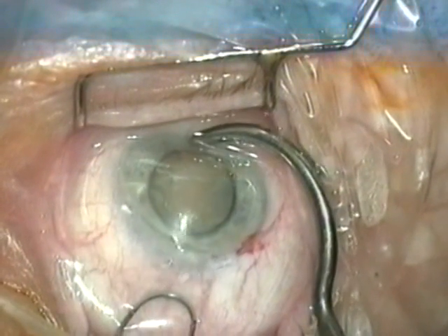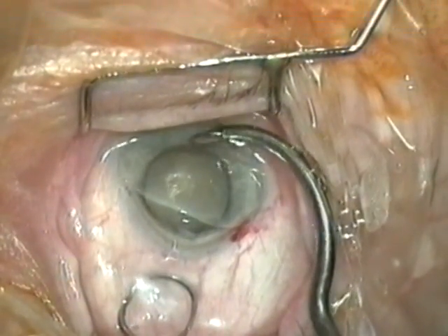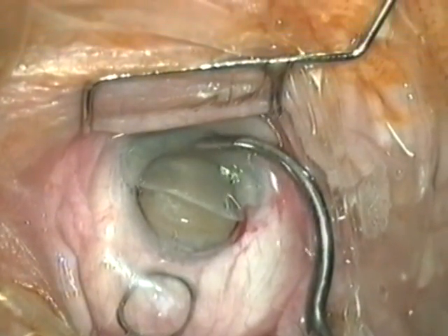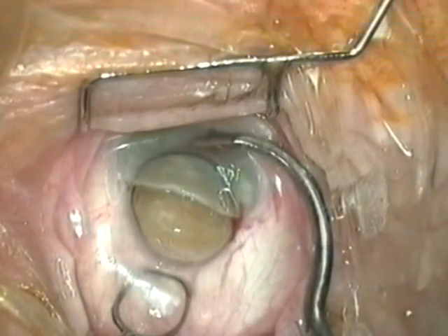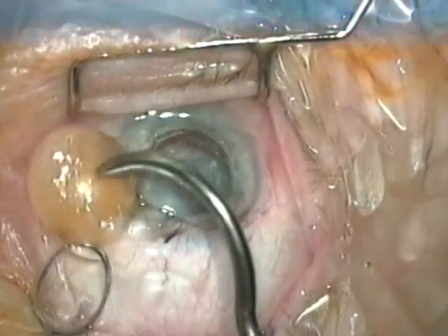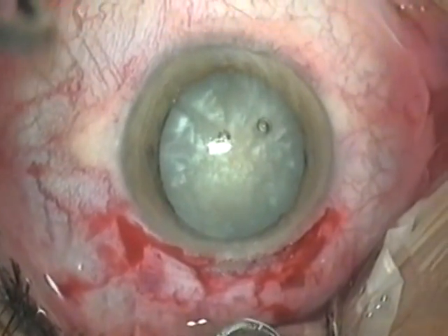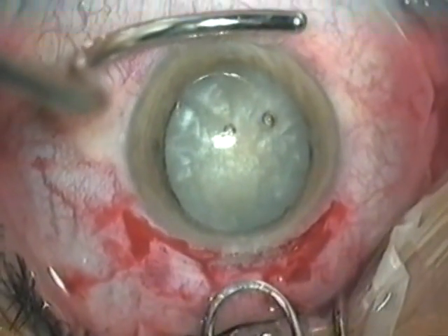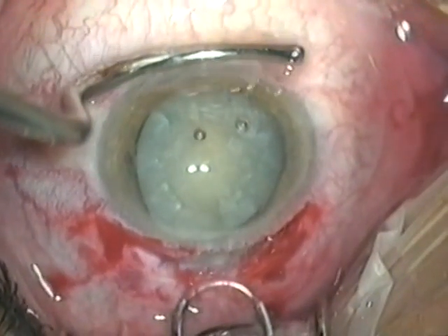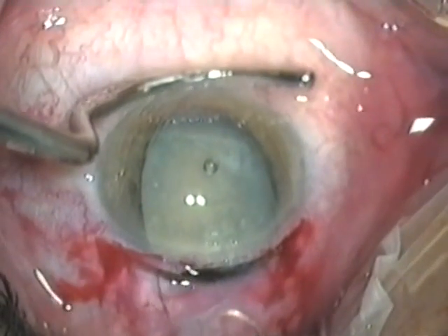At first some viscoelastic comes out of the eye but enough stays in to protect the corneal endothelium. Just as soon as the nucleus starts to come out of the eye, release the pressure from the lens expressor. In this second case the shaft of the expressor is pressing at the lower limbus. You must resist the temptation to massage the expressor across the cornea — at all times keep it at the lower limbus.